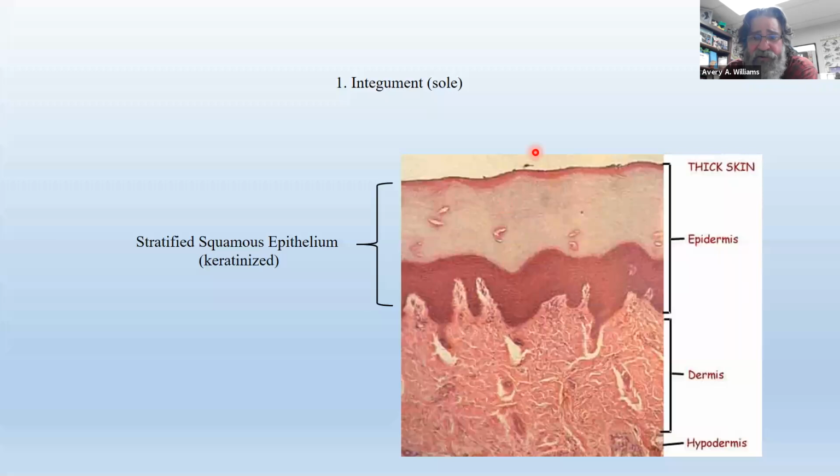But anyway, it looks very, very distinct. So name this tissue, all this tissue from here to here, which forms the epidermis. The name of the tissue that forms the epidermis is stratified squamous epithelium. Okay. And you're going to see, obviously, the exact same tissue, the exact same skin region on the top of the head, but it looks different, right? It would be, of course, has hair, would be very, very thin, because you don't need a big, thick layer of dead cells on the top of your head, right? Because it's not exposed to as much abrasive trauma as the bottom of your feet or the palms of your hand. Okay? So that makes sense.